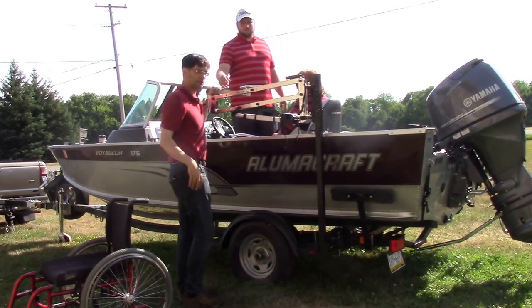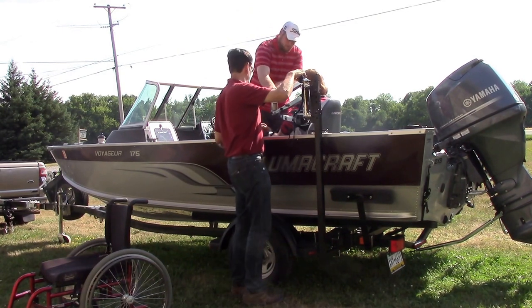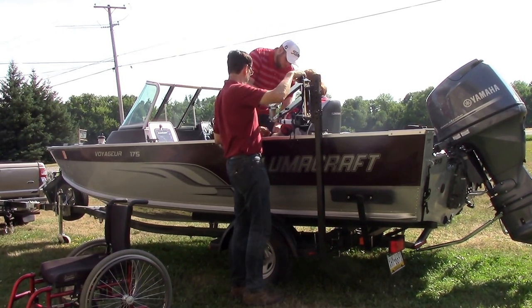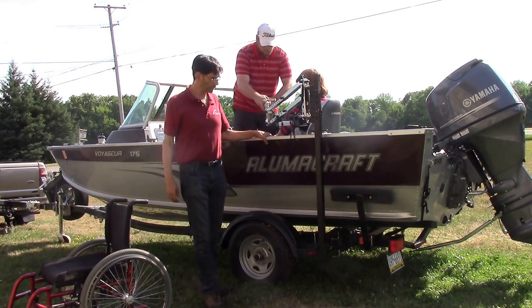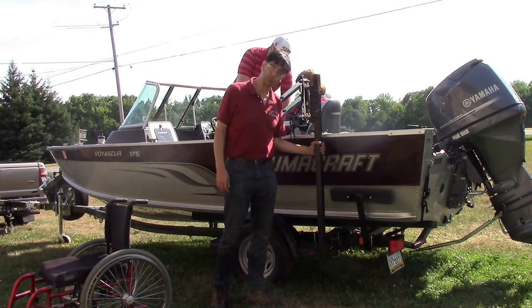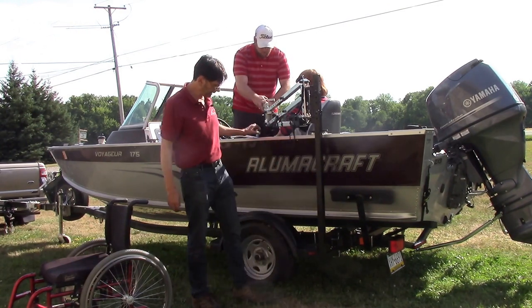For more information, you're going to want to check out the link down below, which will show you how the system works and also a detailed video of the removal and placement of the adapter, the boat adapter.